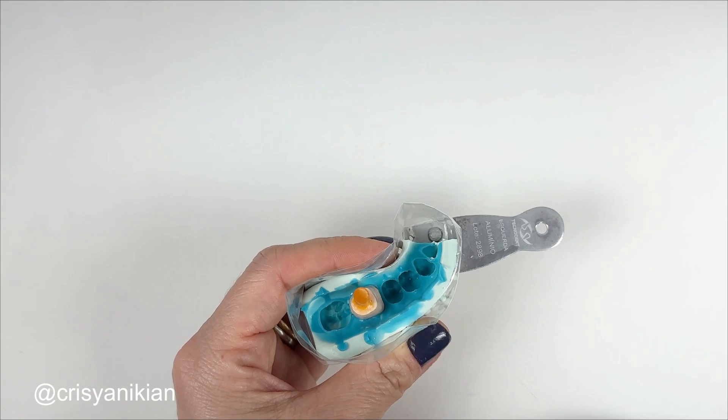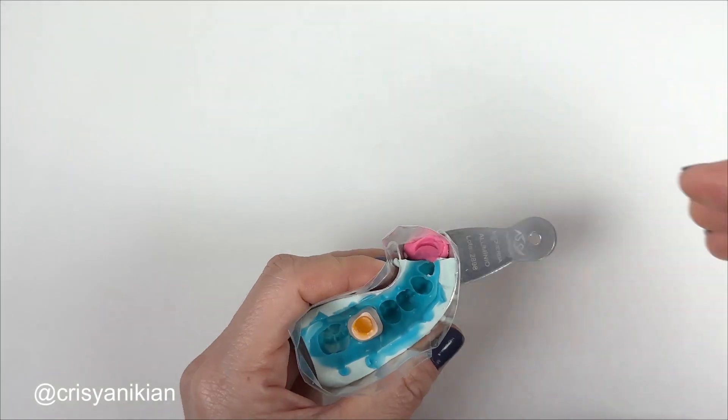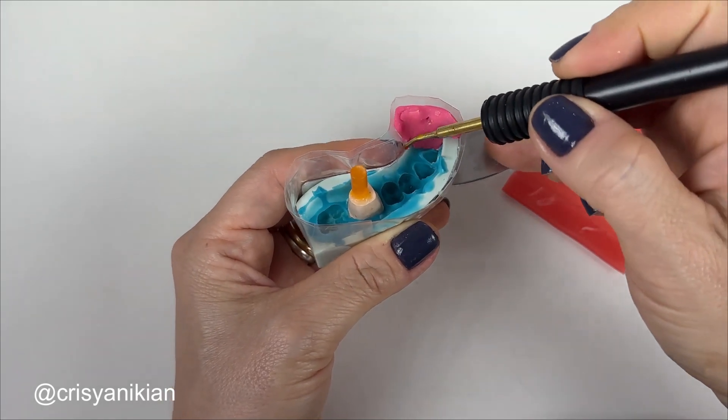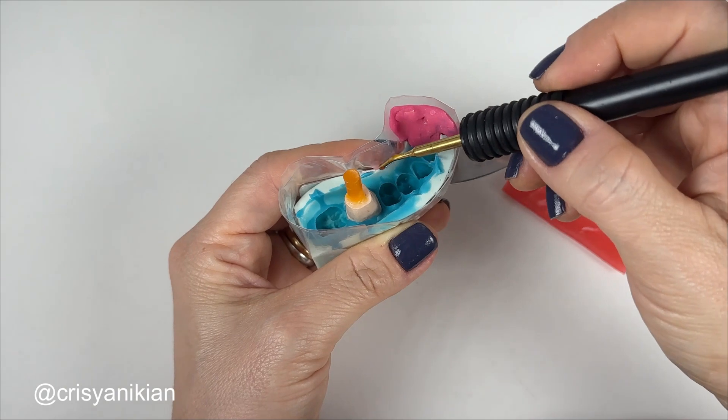Apply plasticized wax to the interface between the adhesive tape and the mold. This way the wax won't run over the edges of the tape barrier.